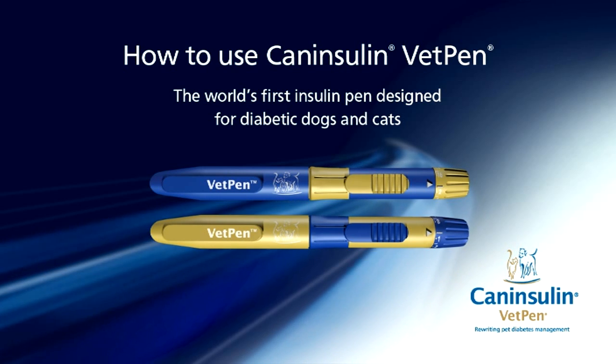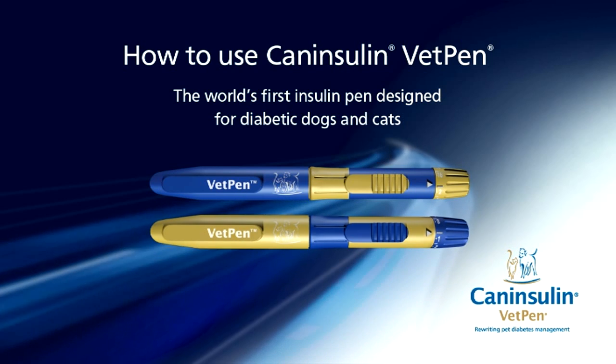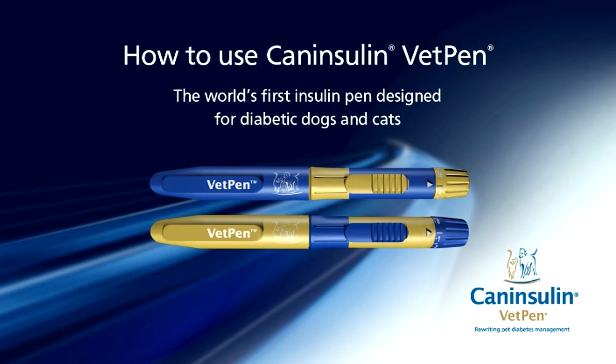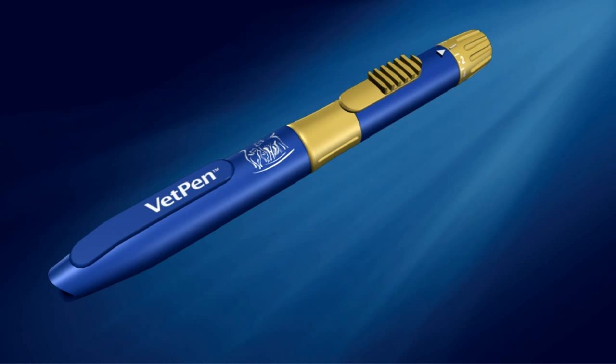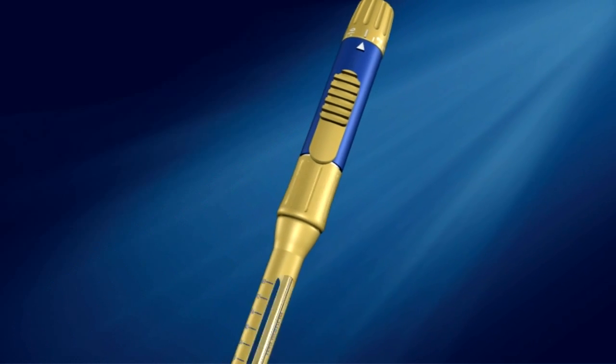VetPen comes in 2 volume sizes. The size you will use depends on the dosage your veterinary professional determines for your pet. No matter which VetPen you have, the instructions for use are the same. First, let's review the individual components of VetPen. The VetPen cap should be removed before attaching a needle and preparing VetPen for use.